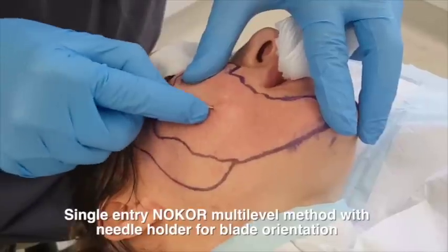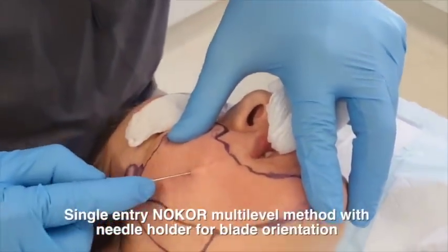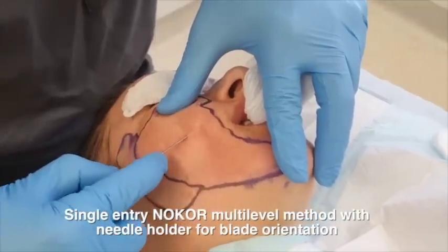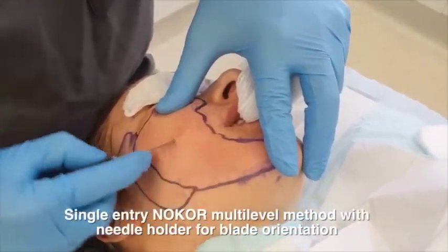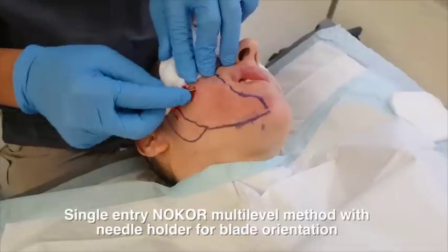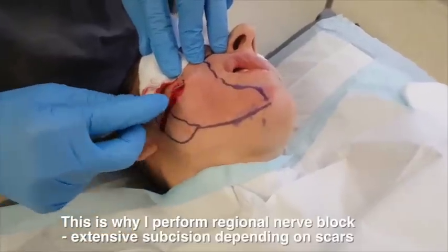Here I am doing a single-entry no-core multi-level method for subcision. This is why I do regional nerve blocks — because if it's as extensive as this, for patient comfort it's very important.